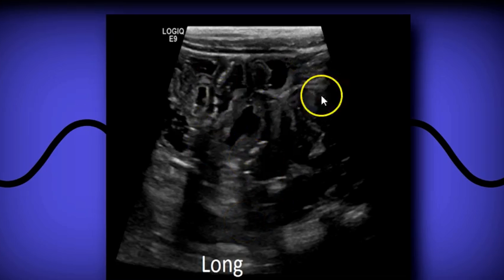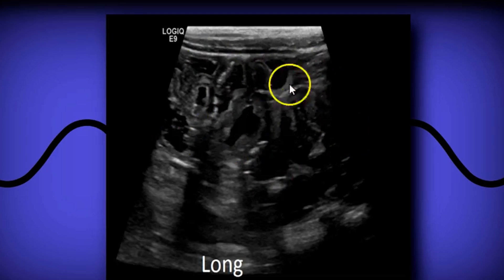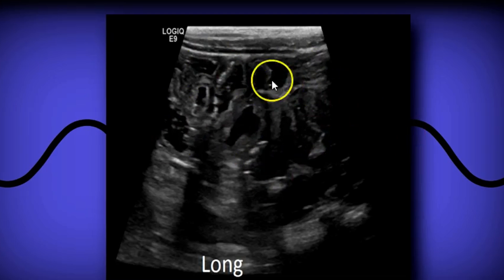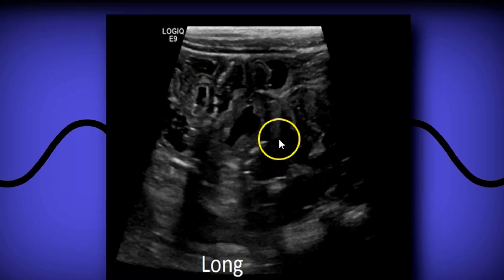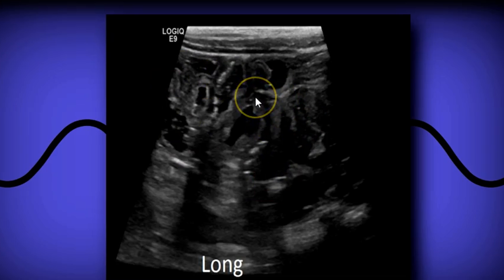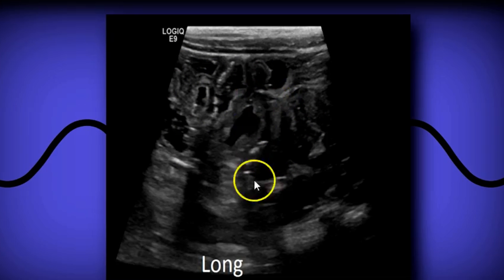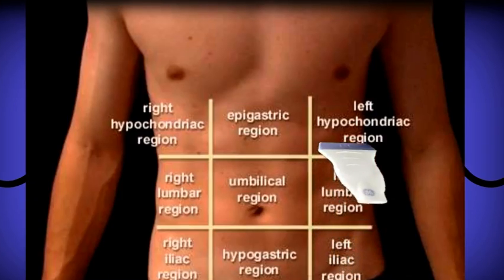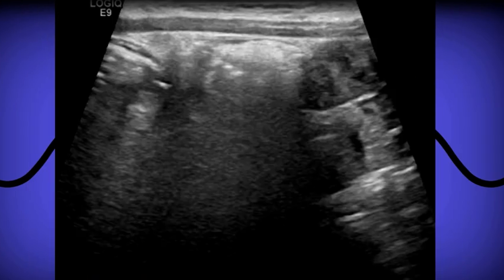If there's no diarrhea, you might just have a lot of gas and air and might not be able to visualize any structures. An ileocolic intussusception will not be found here, but you can have a small bowel intussusception in this area, which is a transient process that usually goes away by itself — you wait 15 minutes.